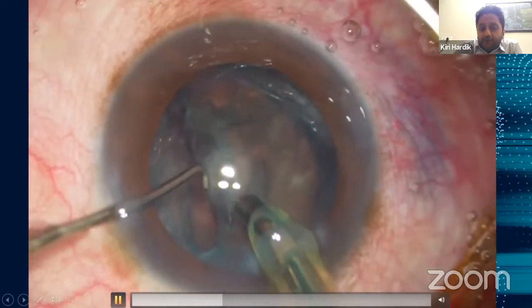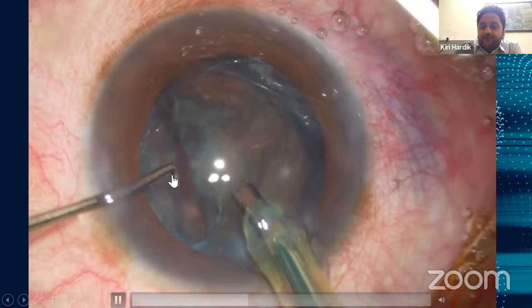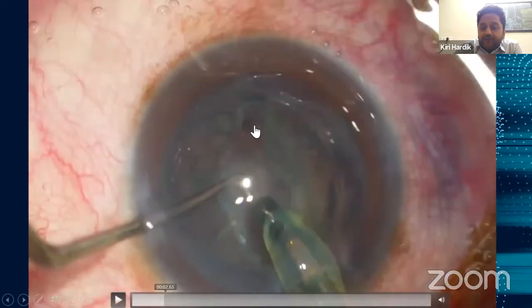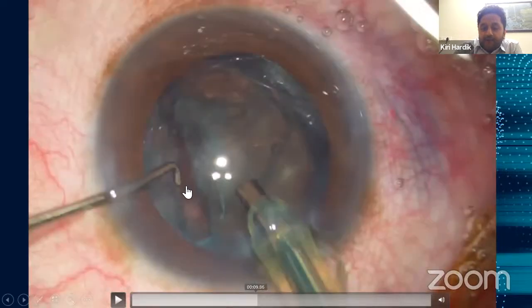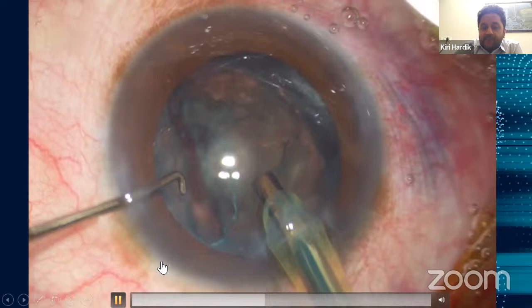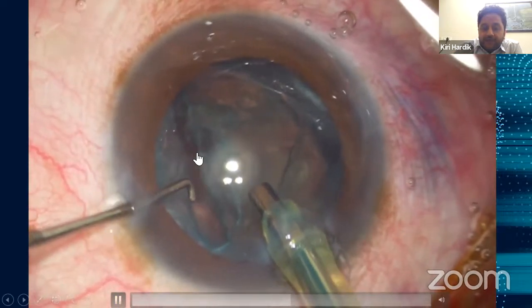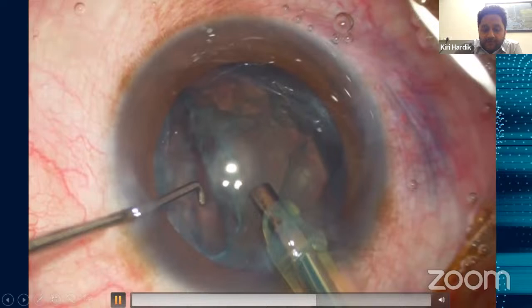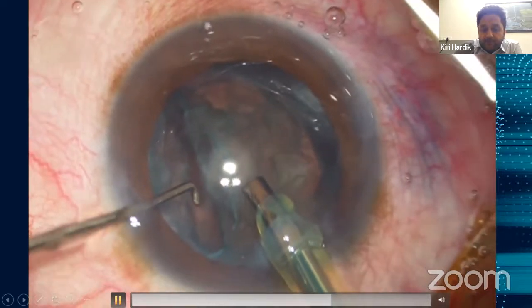And if you observe again, the nucleus has shifted towards one side. At the start of the surgery, the trench is in the center. But after that, if you observe where the trench has moved, it has shifted towards the left side. You can see here suddenly there is an appearance of a red glow. Just let me go over it again.